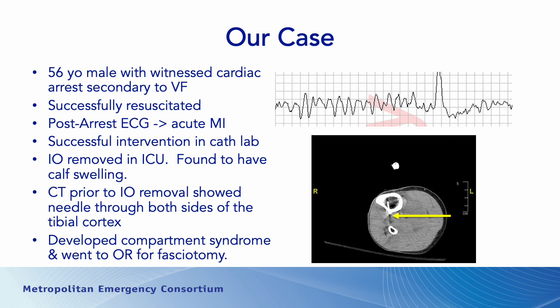But he had a good recovery from his cardiac event, but his discharge was delayed because of the complication of the IO placement. I think we should also note that during this resuscitation, the crew could not easily find the right size IO needle, so they used the big needle that's typically used for humeral IOs, but used it in the tibia. And unfortunately, the needle allowed them to go too far through the bone and into the soft tissue posterior to the tibia. So we'll move on.